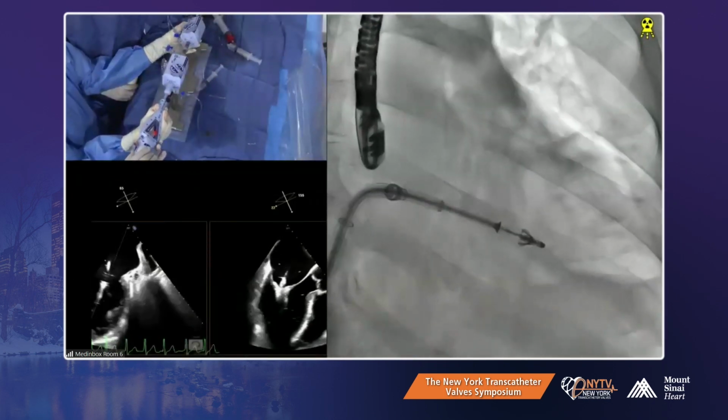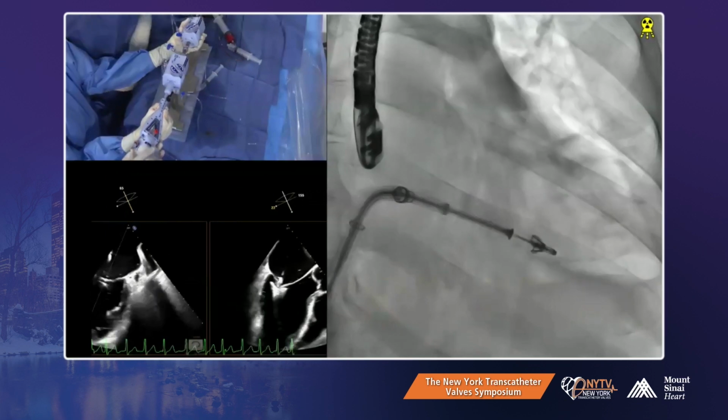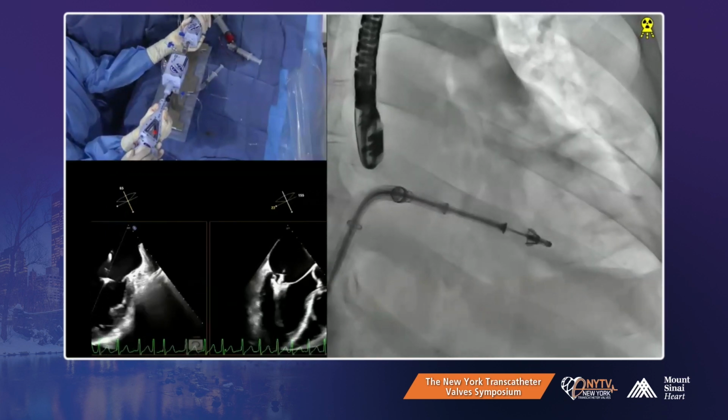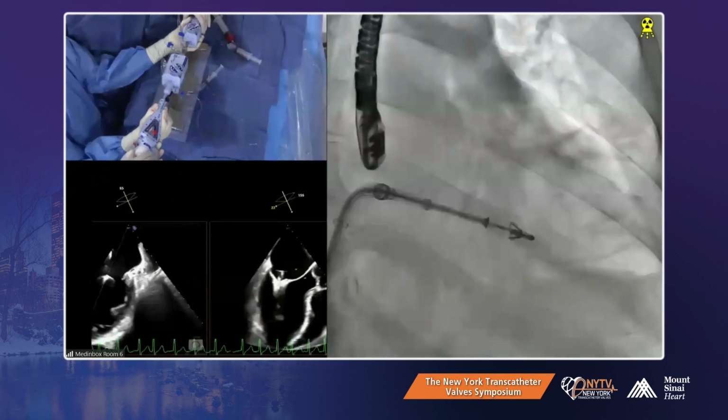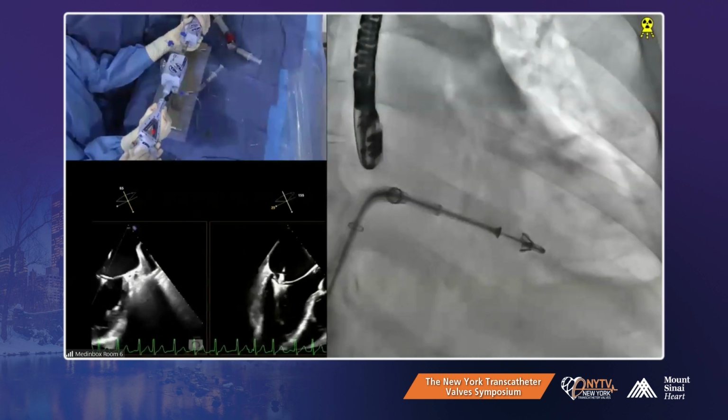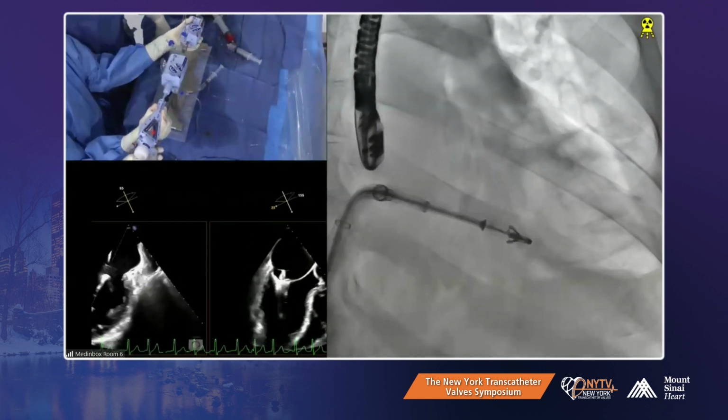Okay, go more posterior. Yeah. Oh, no, too much. Getting better. That's probably the best. Keep pulling up. Open. Yeah, why don't you take that? We're saying take it. Does everybody agree? Take it. Open. Okay, the whole panel agrees.